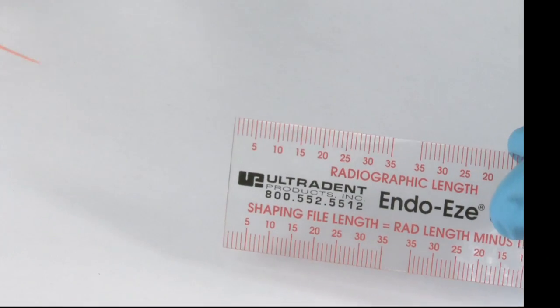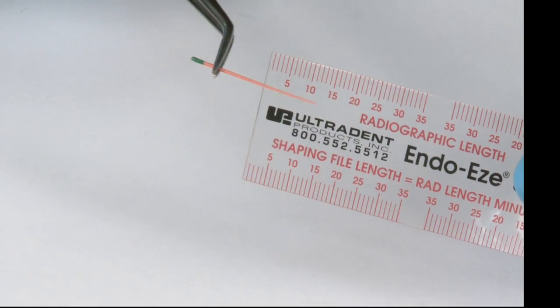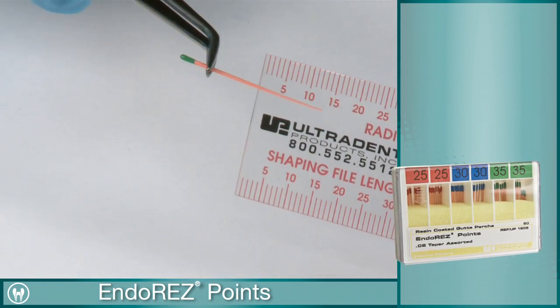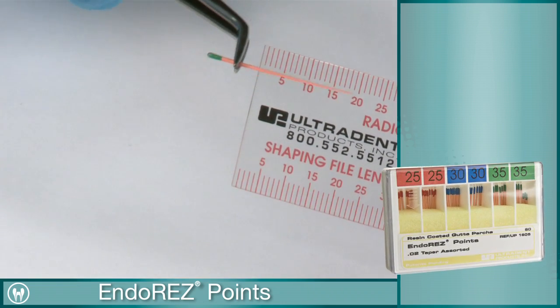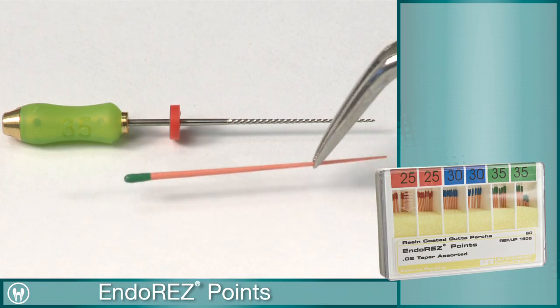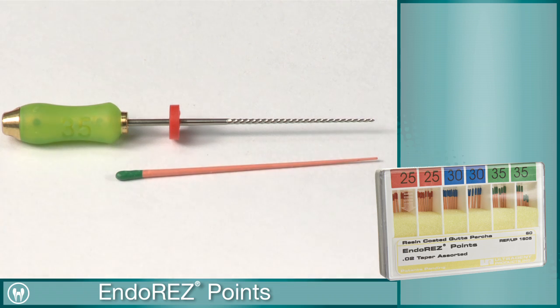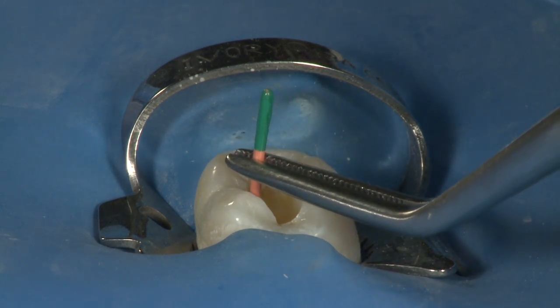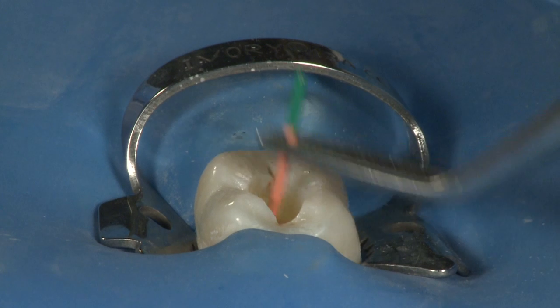Begin the obturation process by trial fitting an EndoRes point into the canal. This point should be measured and locked into cotton forceps at the pre-instrumented length. The size of the point will be determined by the last hand file used for apical enlargement. After gently sliding it to length, verify the fit by checking for a gentle tug back when removing the point.